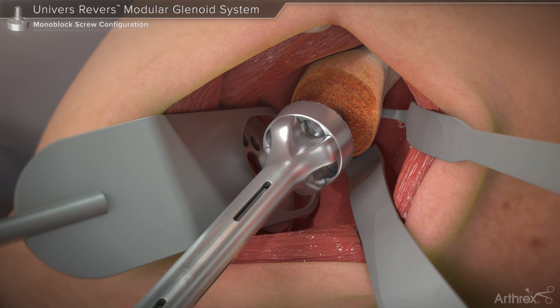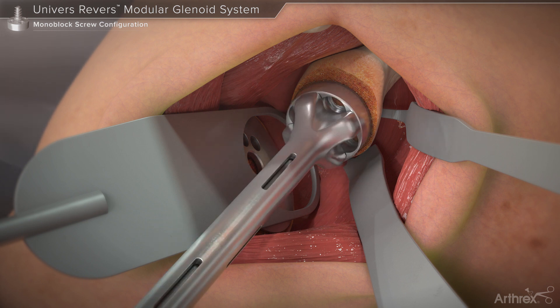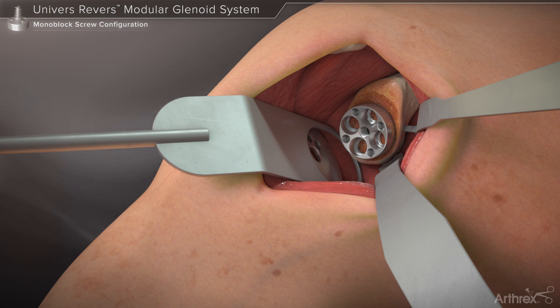The base plate is inserted into the glenoid and is rotated until the base plate is flush to the prepared glenoid surface and/or desired compression is achieved. One may choose between placing locking fixed angle 5.5 mm or non-locking 4.5 mm variable angle screws within each of the peripheral screw holes.